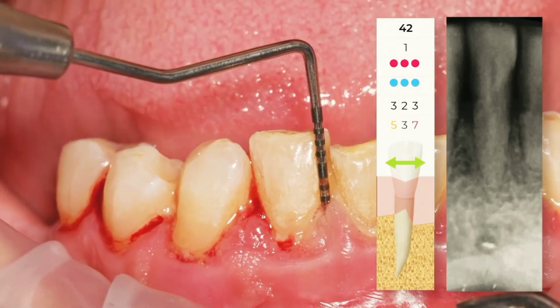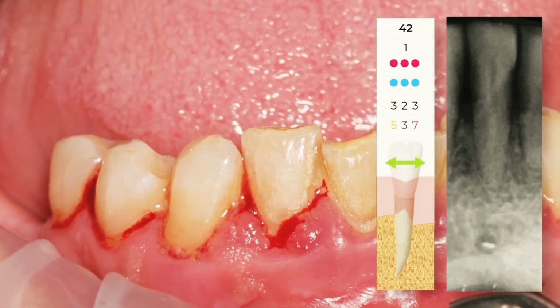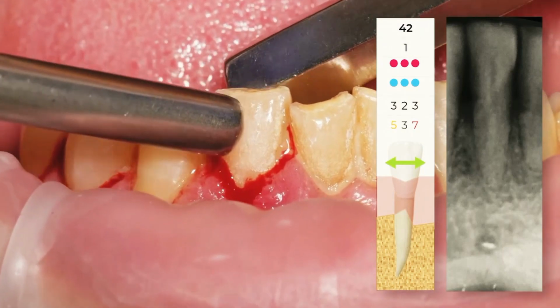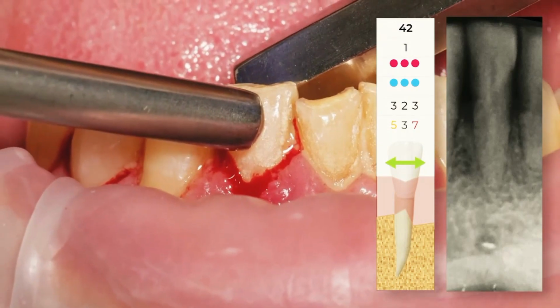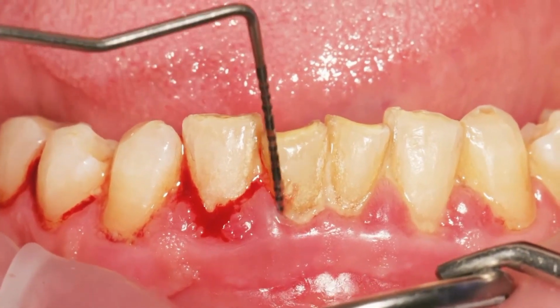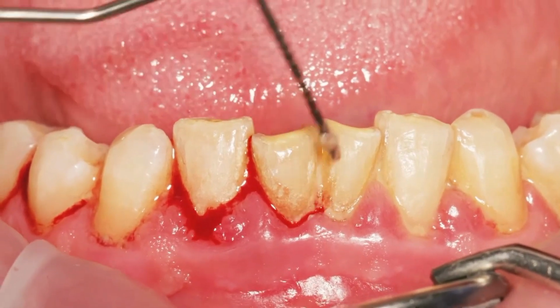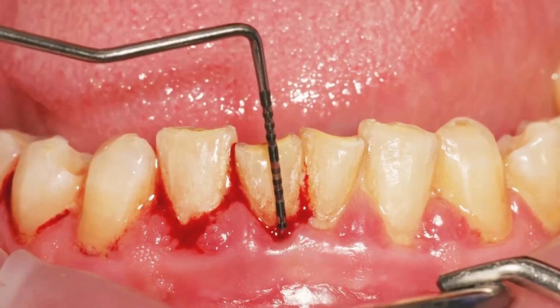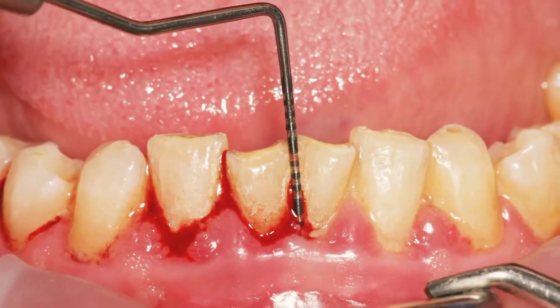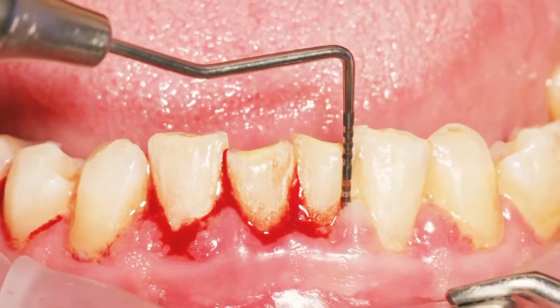And during this kind of probing, we can also have an idea of the quality of the soft tissue to decide if we can use the Perioflow nozzles on that site. So, for example, I showed you this lower incisor because I used the Perioflow nozzles there in this defect, because it's possible.